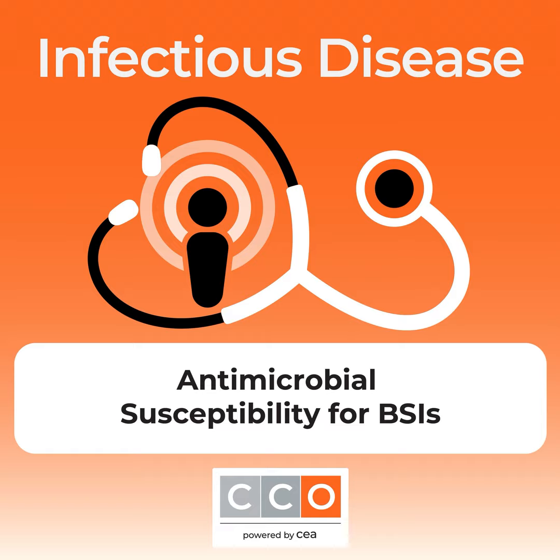So what is the clinical impact? Well, rapid phenotypic AST significantly reduces time to actionable result and can improve antimicrobial decision making. You actually have the full susceptibility profile of the organism. The action depends on the effective implementation, workflow integration, clinical response, and collaboration with the antimicrobial stewardship team. So that is another aspect.